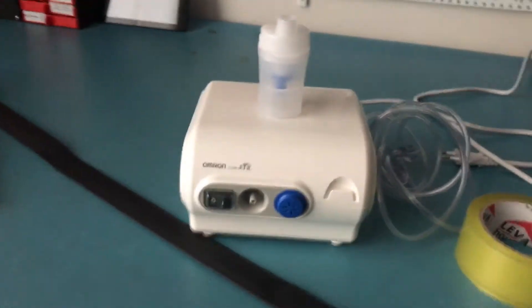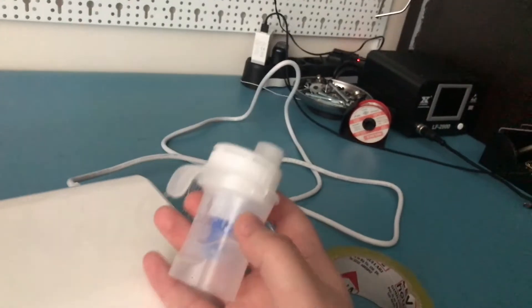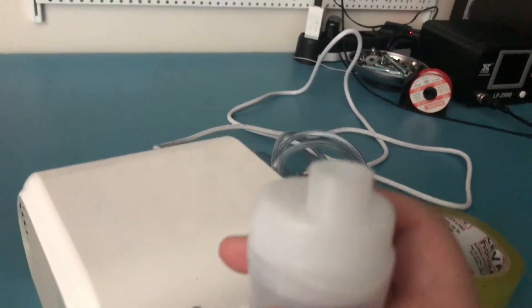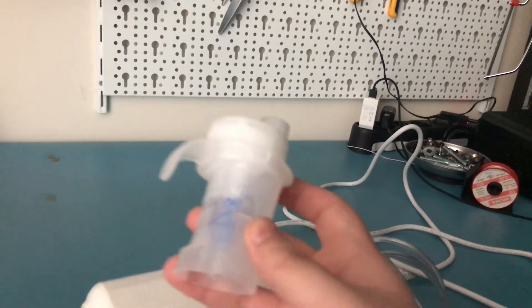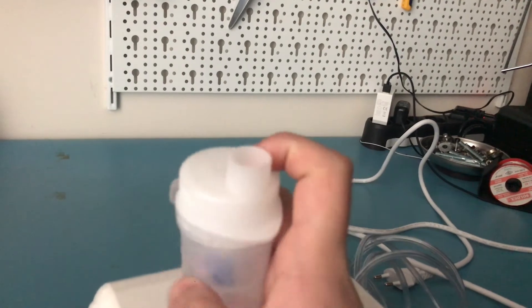I have my nebulizer here. The thing with this nebulizer is the part where you put the medicine — it's not on the unit, but this is supposed to attach to the mask and you just have to hold it upright. The mask is supposed to be here and you hold it like that, but this thing does make a lot of noise and it does scare my cat, so I can't put this in the enclosure.